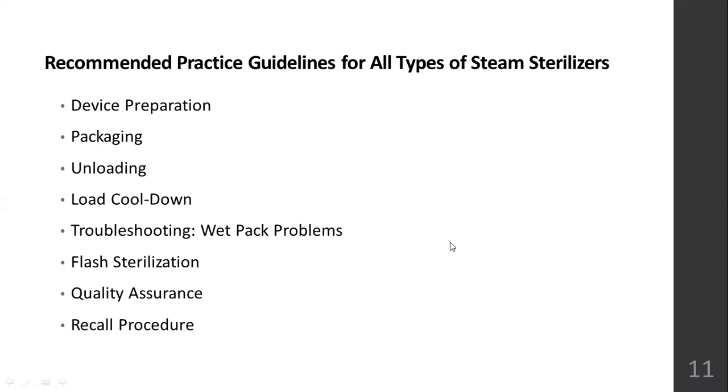Troubleshooting, if at all there is any wet pack problem. There is a moisture pool or water pool that has accumulated in the sterilized or packaged article. So that is a wet pack problem. So troubleshooting has to be done. Some preventive management has to be done for the device that has sterilized it. Immediately, if the water pool is present in the sterile kit, do not use it. Immediately put it back again for the next load for sterilization. Don't use it again.